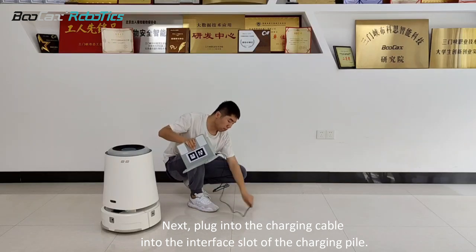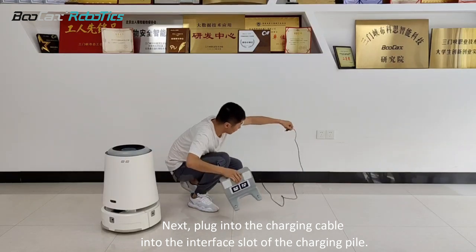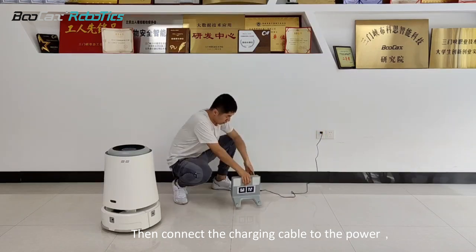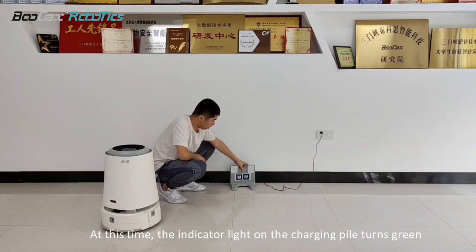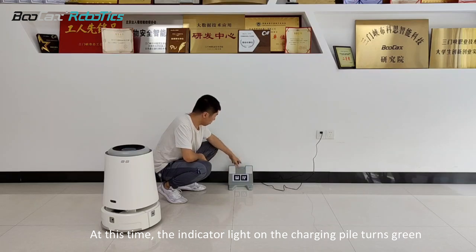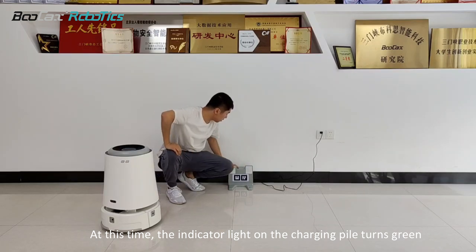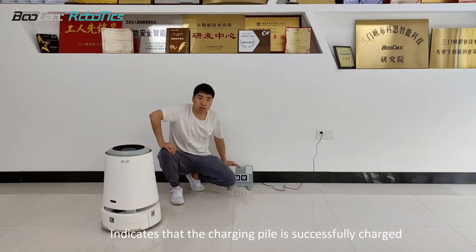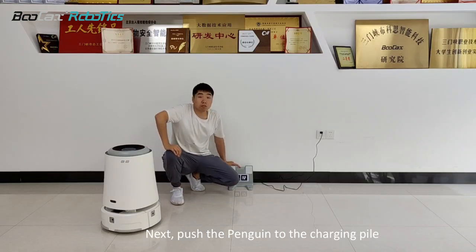Next, plug the charging cable into the interface slot of the charging pile, then connect the charging cable to the power. At this time, the indicator light on the charging pile turns green, indicating that the charging pile is successfully charged.